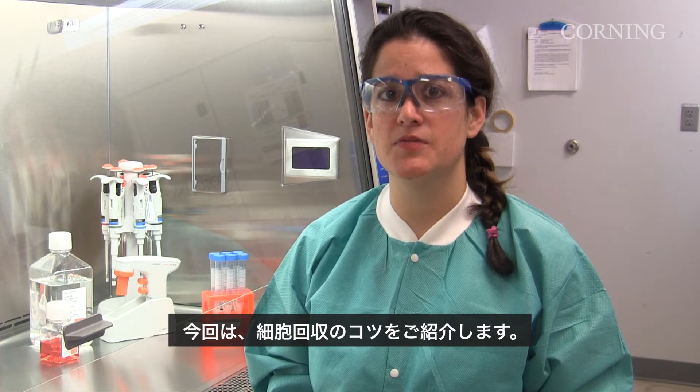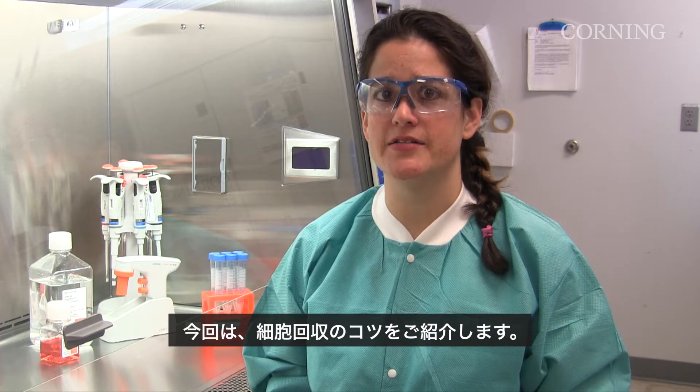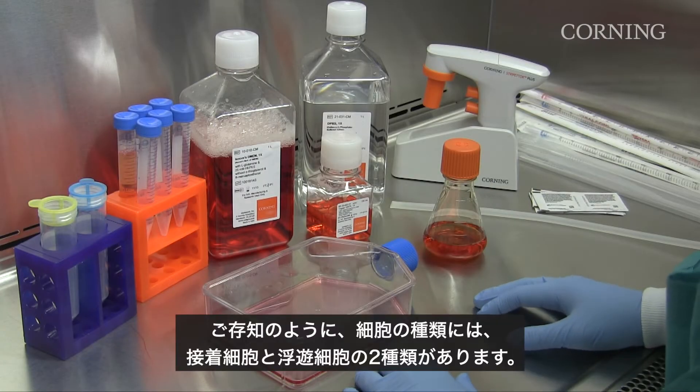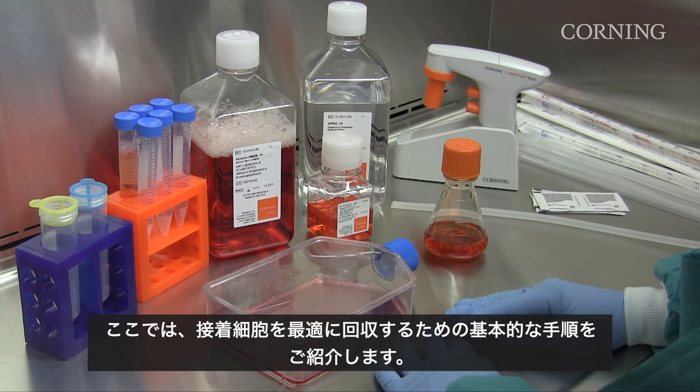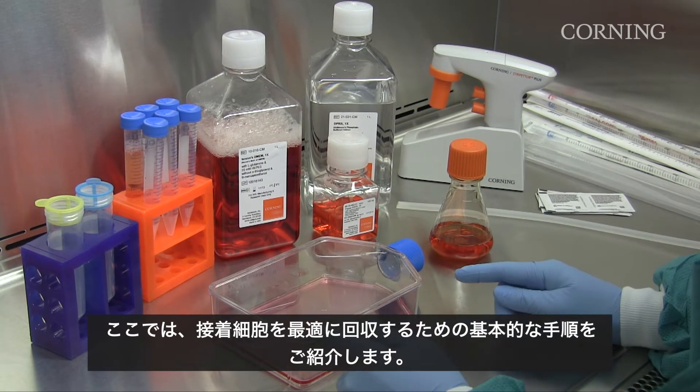Today we will discuss some tips and tricks for harvesting your cells. As many of you know, there are two types of cell lines: adherent and suspension based cells. Here are the basic steps for optimal harvest of adherent cell lines.